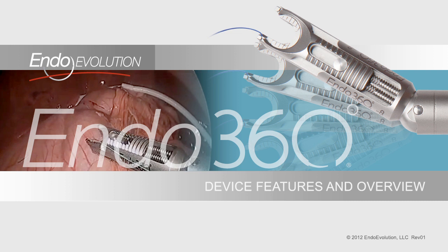This video will illustrate, demonstrate, and describe the key features of the EndoEvolution Endo360 Minimally Invasive Suturing Device.